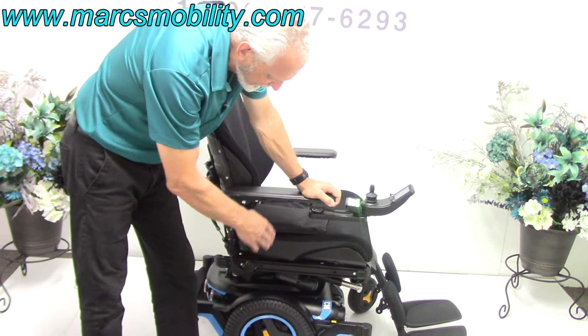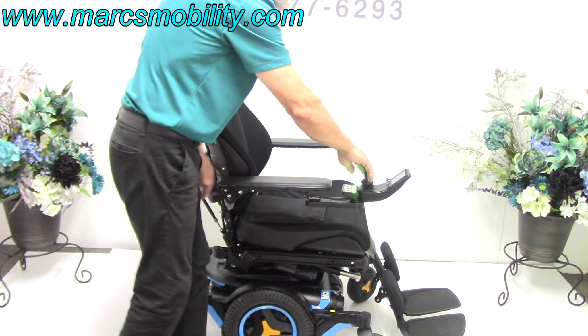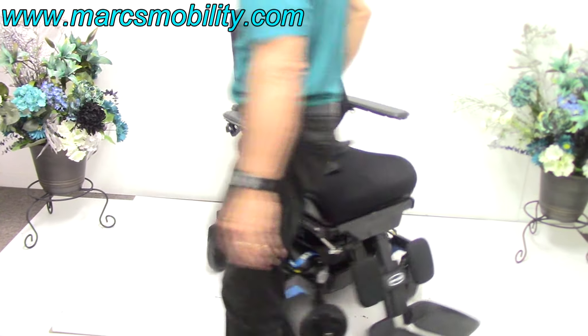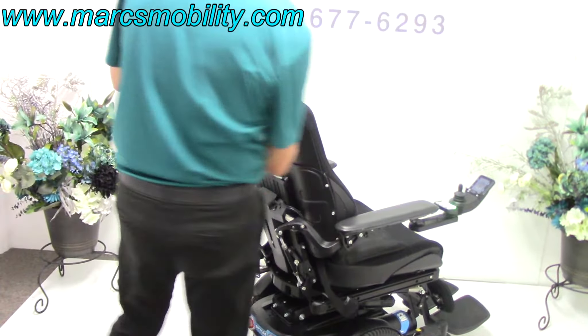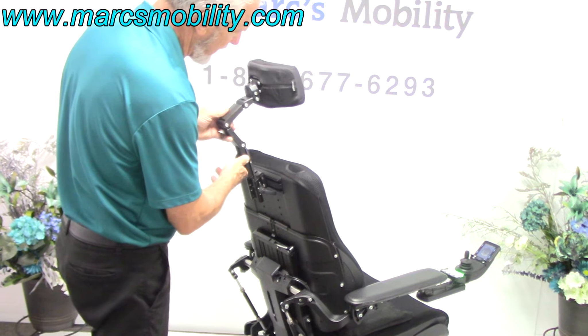This is a mid-wheel drive chair, so it'll turn around its own length — whatever the length of the chair is, that's what it takes to go in a circle. On the back of the chair you've got a headrest that is fully adjustable, and it can also be removed if you don't want it.